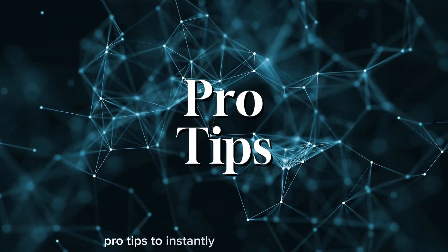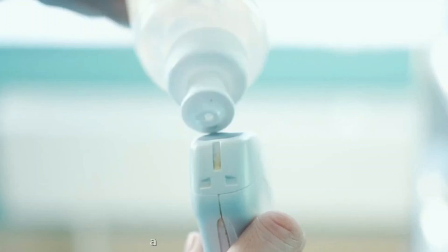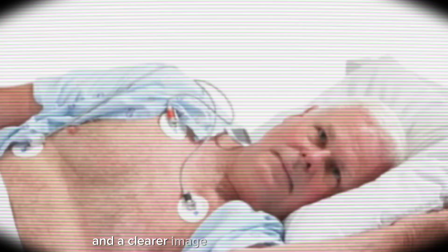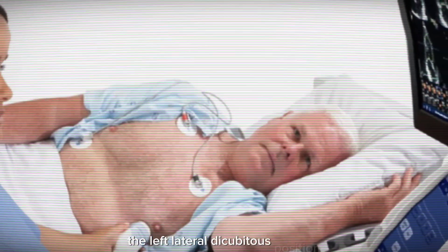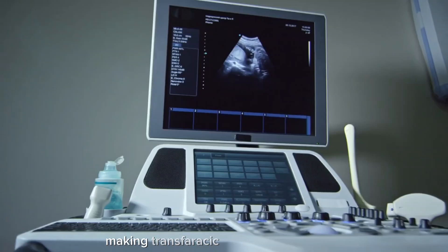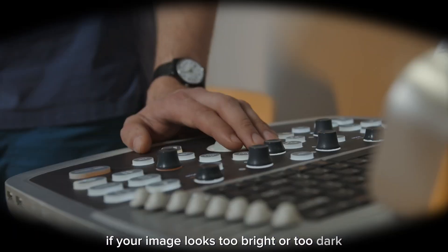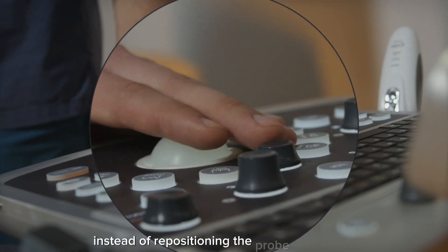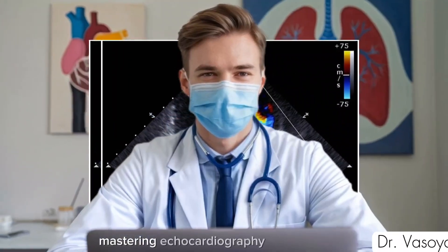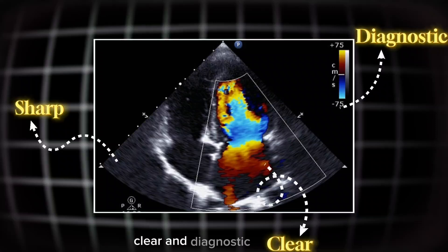Pro tips to instantly improve your imaging. Use plenty of gel — air is your biggest enemy in ultrasound, and a generous amount of gel ensures smooth ultrasound wave transmission and a clearer image. Check patient positioning: the left lateral decubitus position — lying on the left side — brings the heart closer to the chest wall, making transthoracic imaging much easier. Adjust depth and gain settings: if your image looks too bright or too dark, tweak the gain settings instead of repositioning the probe repeatedly. Sometimes a small setting change makes all the difference. Mastering echocardiography takes practice, but once you get the hang of probe positioning, your images will be sharp, clear, and diagnostic every time.